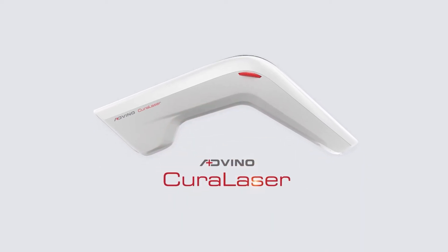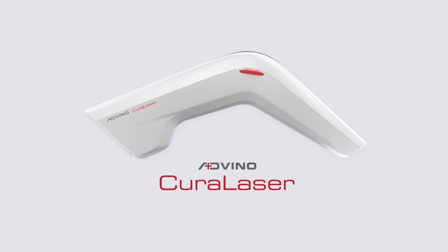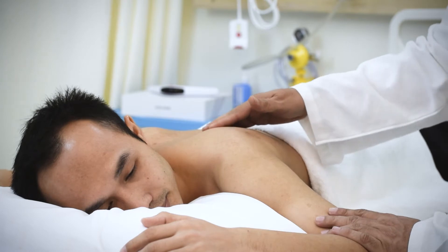This video demonstrates the use of Adveno Cura Laser in neck pain. Assess the neck for swelling, inflammation, and muscle spasm before starting the treatment.